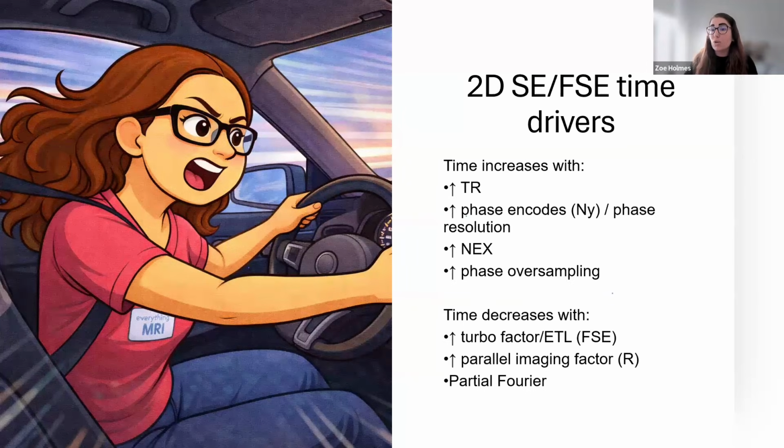So it's going to come down to what your sequence is. If you're going for a T1, you're going to have to abide by a smaller echo train. And then if you're going for a T2 and STIRs, you can use higher. You can't push the system too hard, otherwise you are going to introduce that blur. And that's going to take away all the benefit that you've tried to get back into your images.